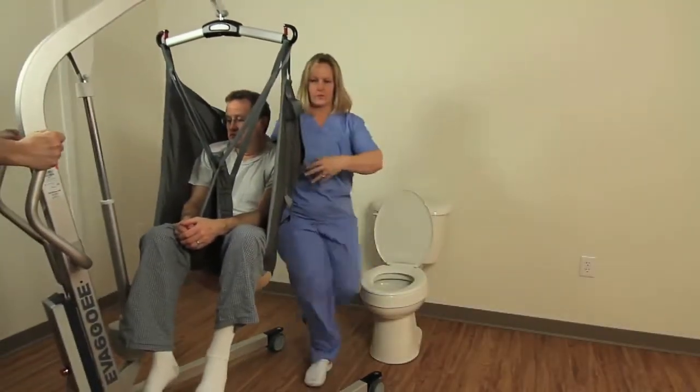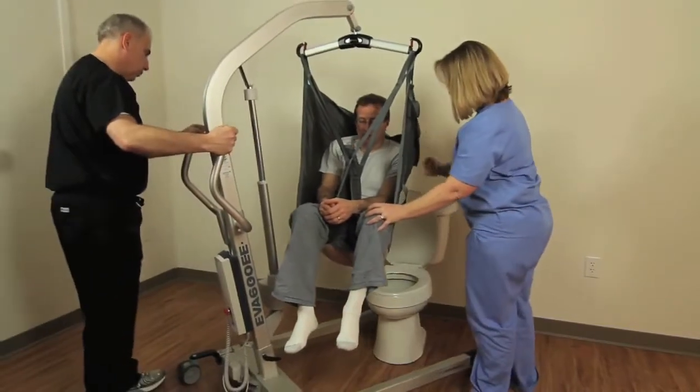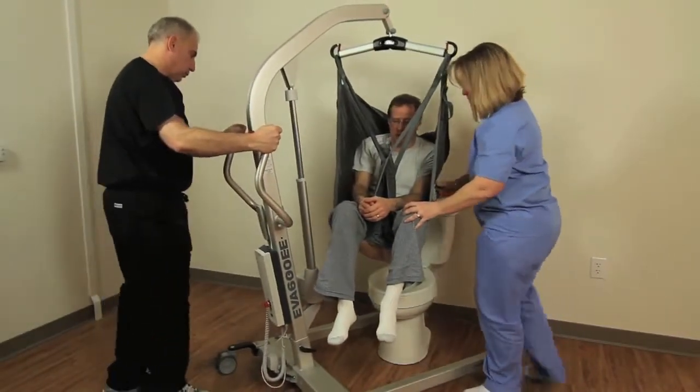Transferring a patient to the toilet involves much the same procedure as transferring to a chair. To illustrate a toilet transfer, we are using a commode.